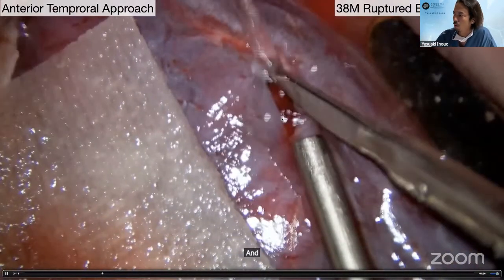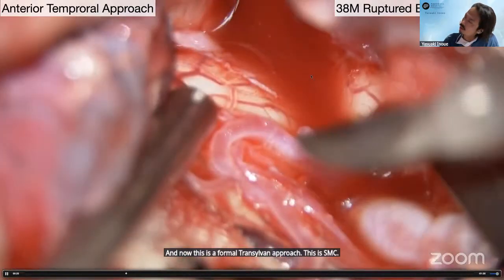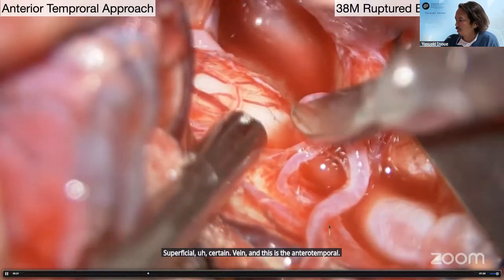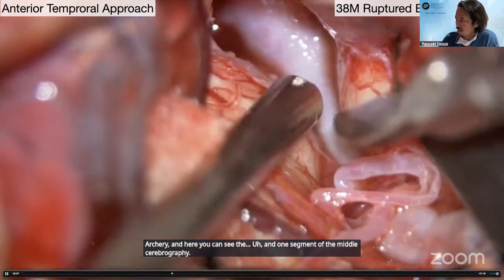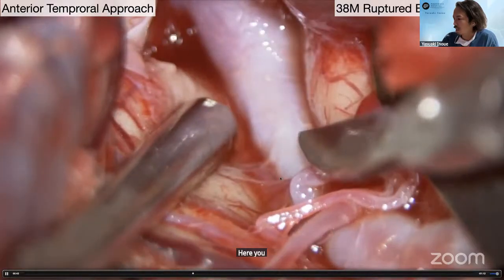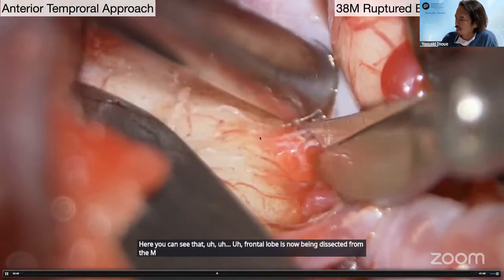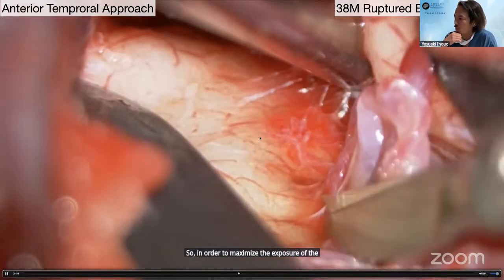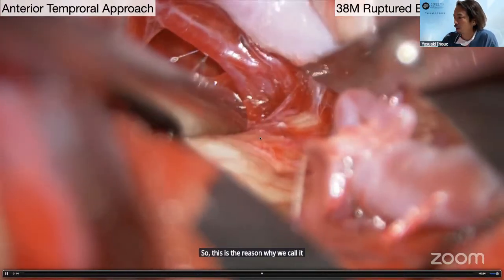And now this is a formal transsylvian approach. This is the SMCV, superficial sylvian vein, and this is the anterior temporal artery. Here you can see the M1 segment of the middle cerebral artery. The first key point of the anterior temporal approach is this part. Here you can see the frontal lobe is now being dissected from the M1 segment. In order to maximize the exposure of the retrocarotid space, we have to mobilize the temporal lobe. This is the reason why we call it the anterior temporal approach.